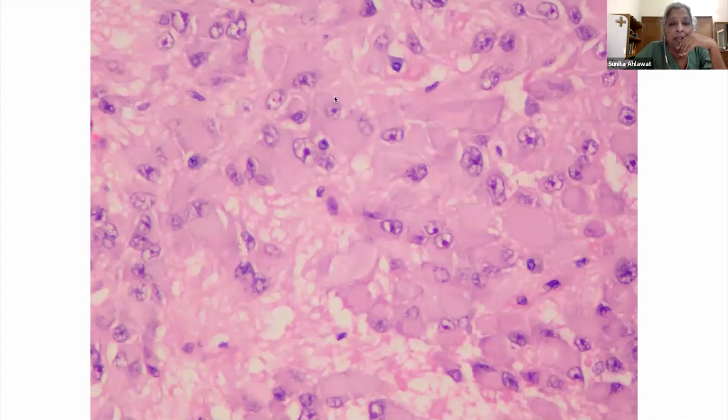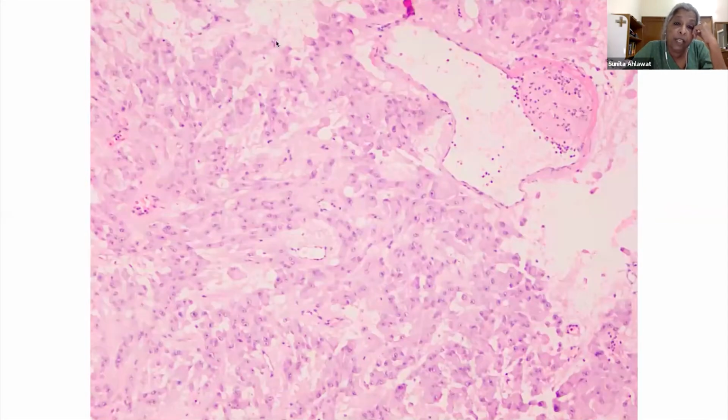Glassy cytoplasm, large nucleus, prominent nucleolus, tumor in the lateral ventricle in a child. And these tumors also have both glial and neuronal components. Yes, this is SEGA. This is the classical textbook picture morphology that you see.